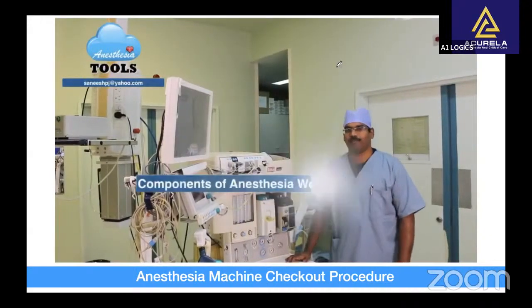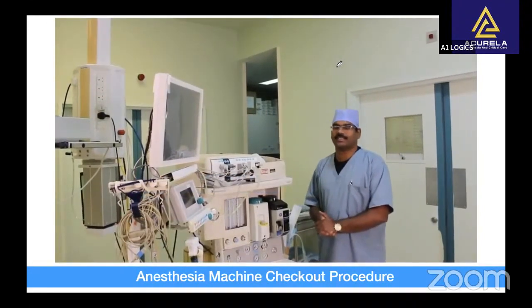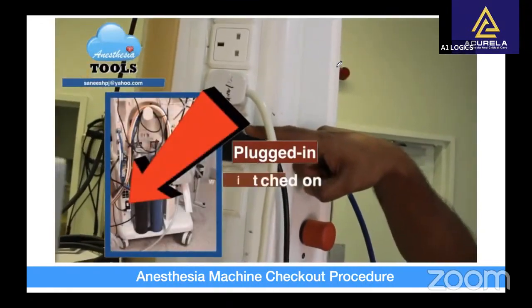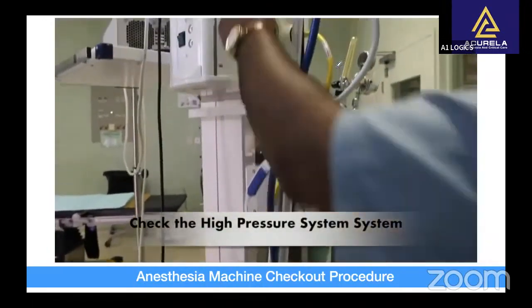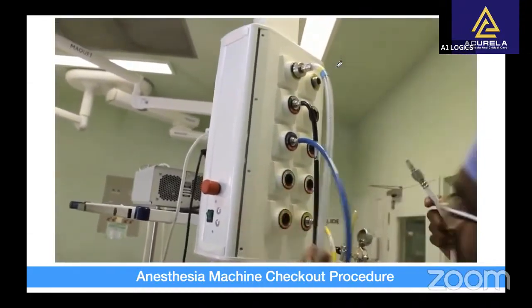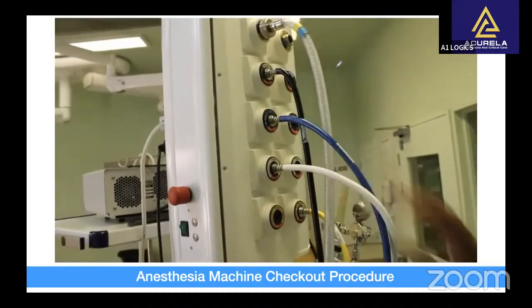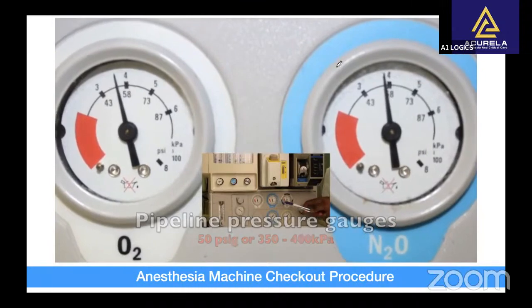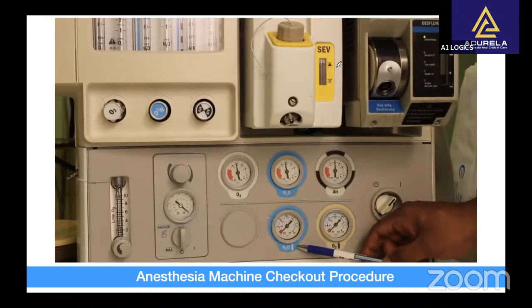Modern anesthesia workstations have pneumatic components as well as electrical components. So, our machine checklist starts with making sure that our machine is plugged in, switched on, and adequate battery backup is ensured. Check the high pressure system. Check with a tug test that each pipeline is correctly seated and in the appropriate wall outlet designated for the specific gas. See that pipeline pressure gauges read 50 psig of pressure. Right now cylinder pressure gauges should read 0.